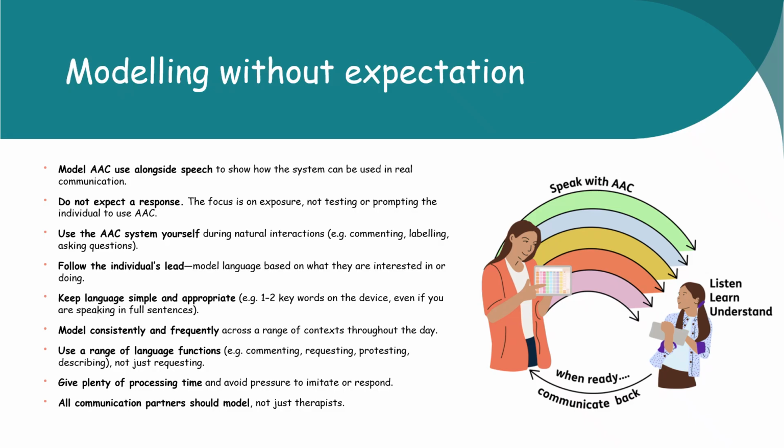So the key idea is that we are showing and we are not testing. So we use the AAC system alongside our speech to demonstrate how it can be used in real situations. What I mean by this is that we're using our AAC all the time and we're modelling it to the child, but if I was working with a child called Harry, I'm not expecting Harry to suddenly start tapping and saying that he wants this, he wants that, because I'm modelling it with no expectation.